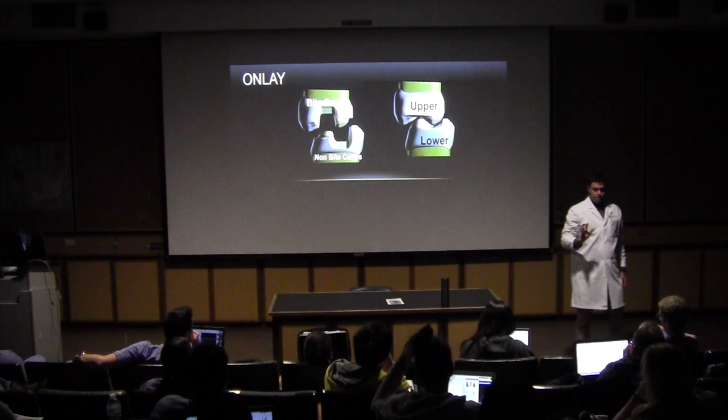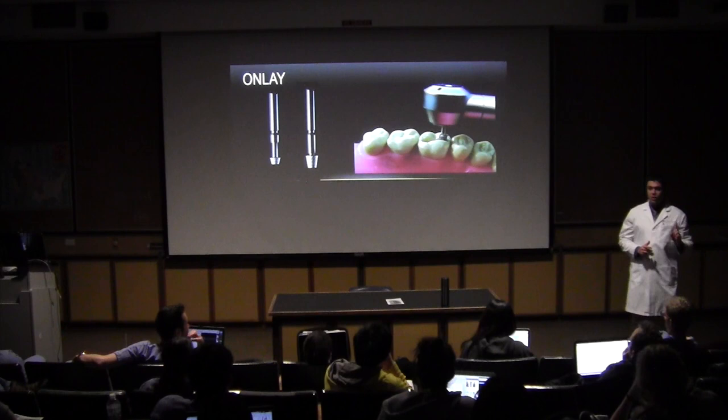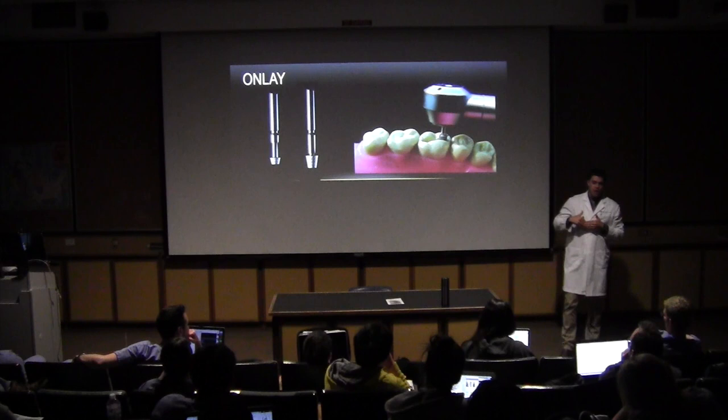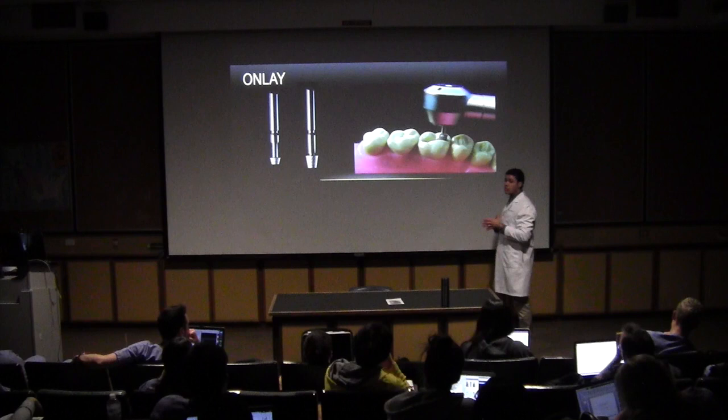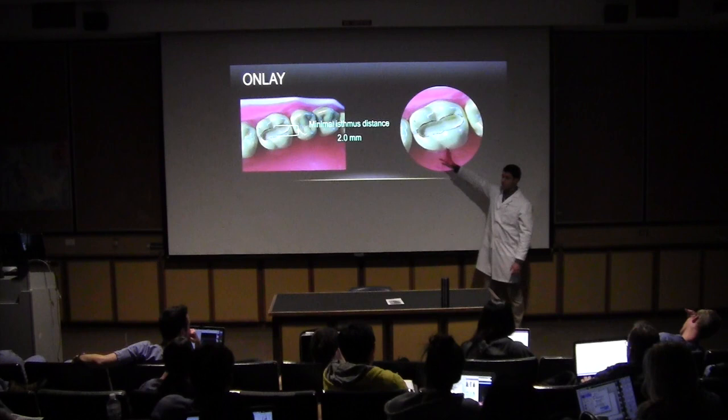So we are going to start our prep the same way, keeping the long axis of the diamond point parallel to the long axis of the tooth, and do a straight occlusal box. Don't follow the grooves. You don't need to follow the grooves here. It's not a conservative prep. Again, the minimal isthmus distance will be 2 millimeters. We will achieve this with the active tip of the diamond point.